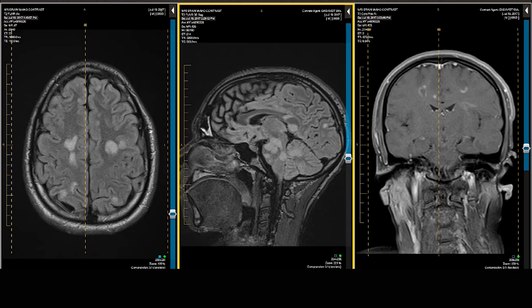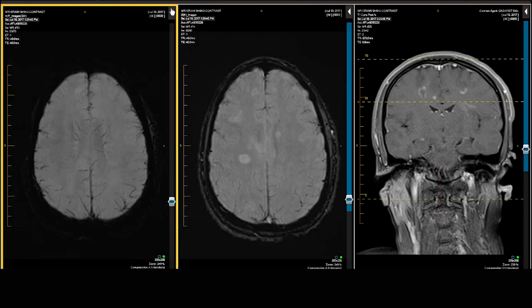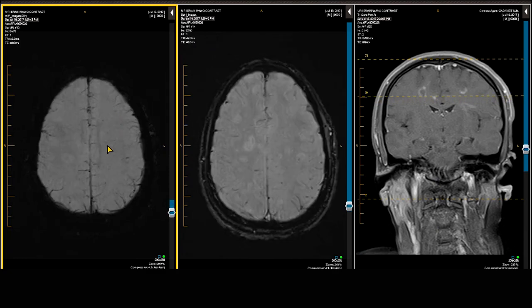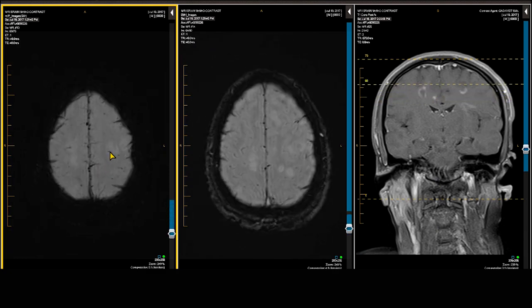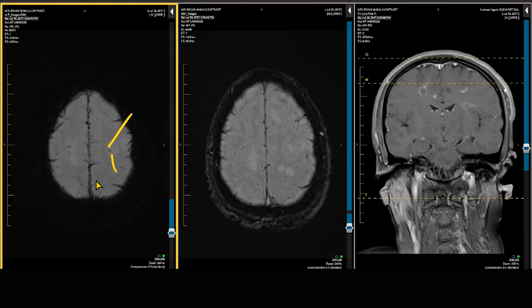This patient also had susceptibility-weighted images performed. You can get a sense of the central vein identified in some of the plaques, with perivenular demyelination indicative of multiple sclerosis.